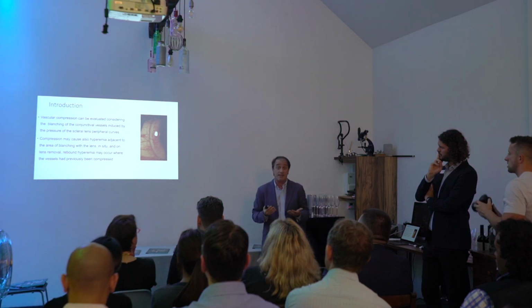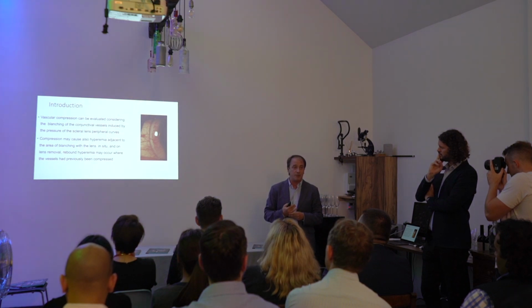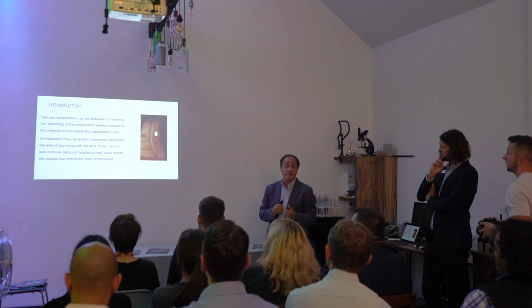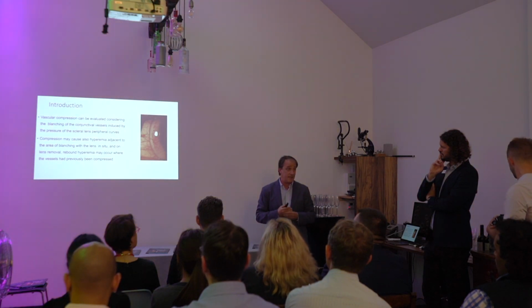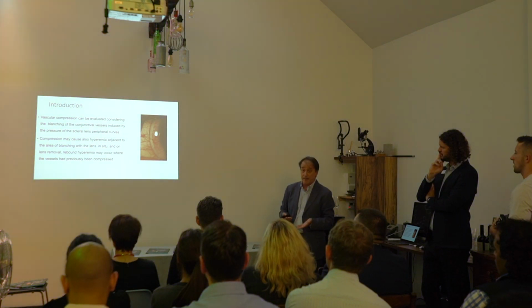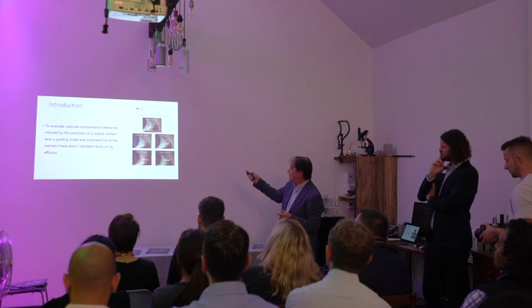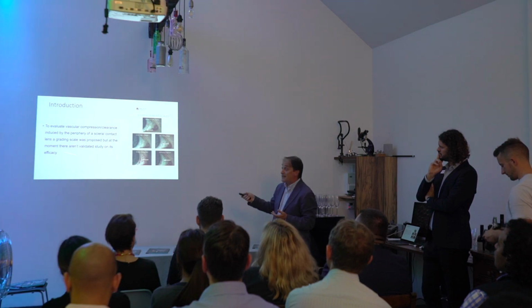And normally, which is the measurement we have to do using the slit lamp? So, evaluate the bulbar redness or the vessel compression. And this is something the AOS anterior can do in an automatic way. And for this, there are some grading scales too. This is a grading scale from Ferris State University. It's useful, but not validated at the moment.